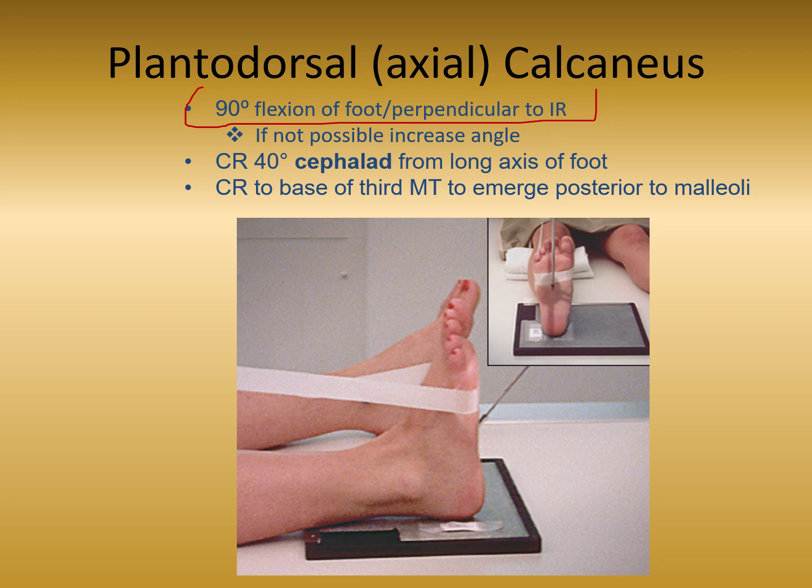Center the ray at the base of the third metatarsal. It's going to emerge near the posterior malleoli, posterior to the malleoli, which are here, right? So if that beam continues on, it's going to exit posterior to those malleoli.